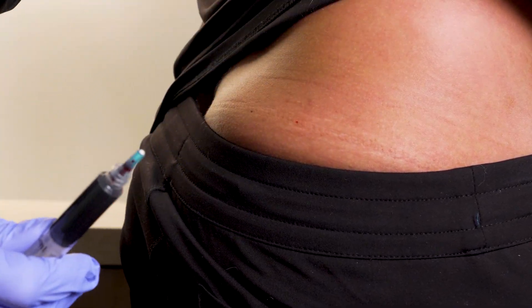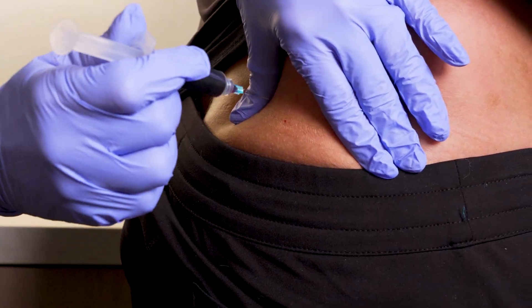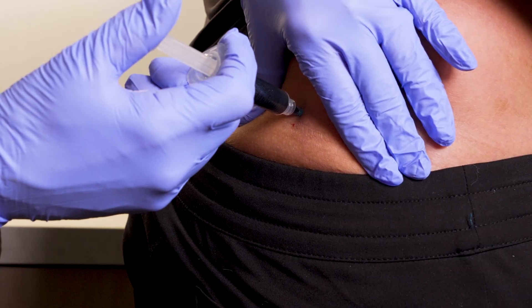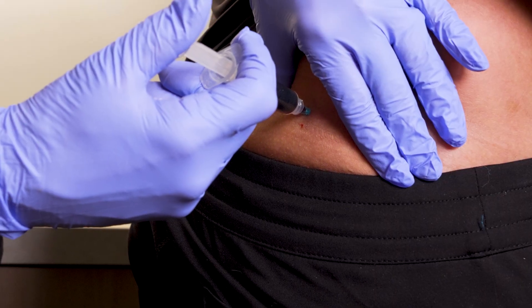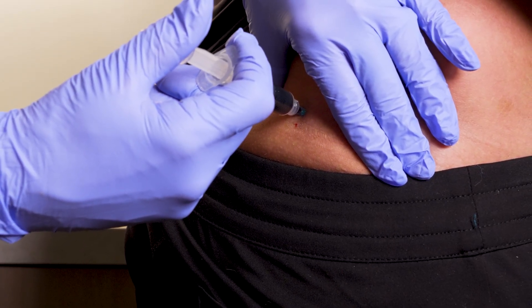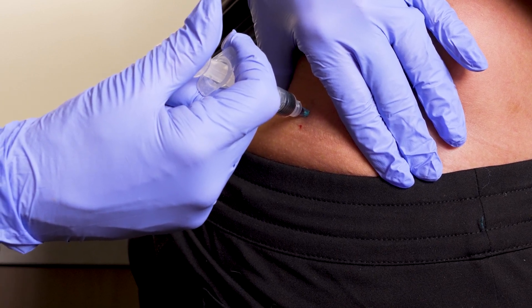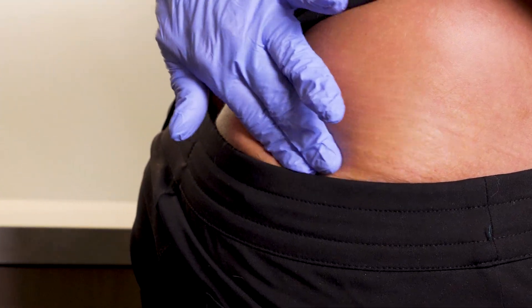For the B12, we want to take the cap off. We're going to pinch the area and put the needle straight in. You want to inject slowly as this B12 does have a burn. It is also 5 cc's, which is a lot for any muscle to handle, but the glute is the biggest muscle and can take 5 cc's.